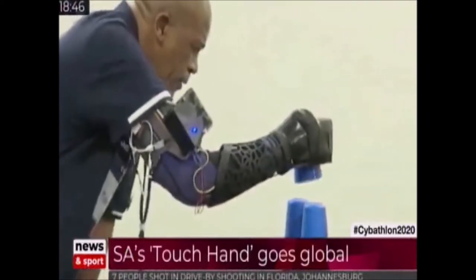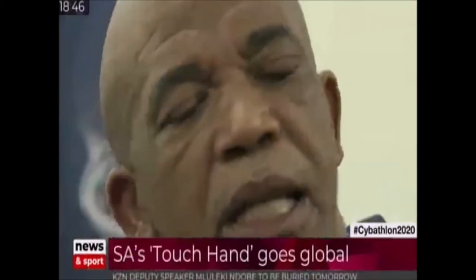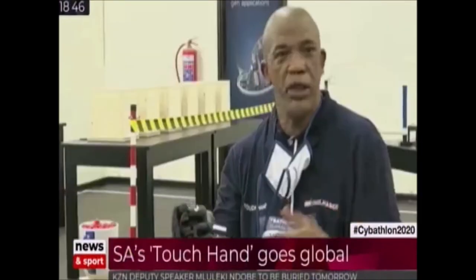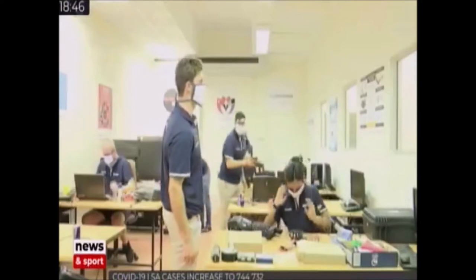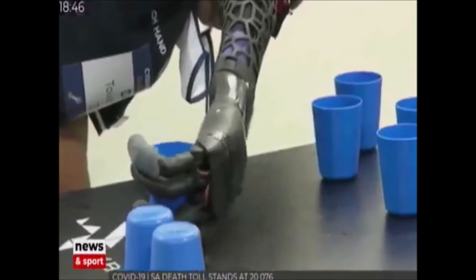Lungile Dick is one of the disabled participants representing the South African team with the Touch Hand. He lost his hand during a workplace accident in 2006. He says it may not be as high-tech as people want, but to a person with a disability it means a lot — that he can pick up something, pick up a ball, write. It adds value. The bigger picture for the team is a dream to provide low-cost prosthetics to disabled South Africans.